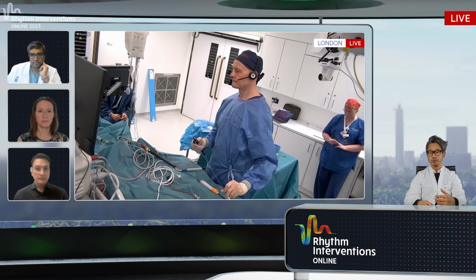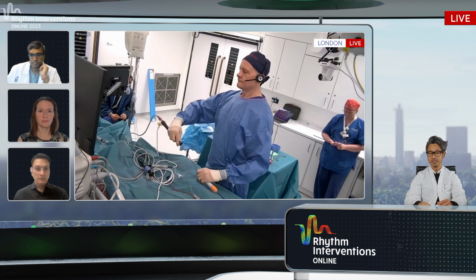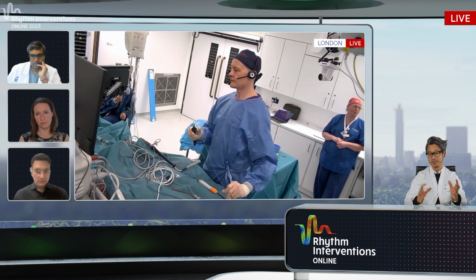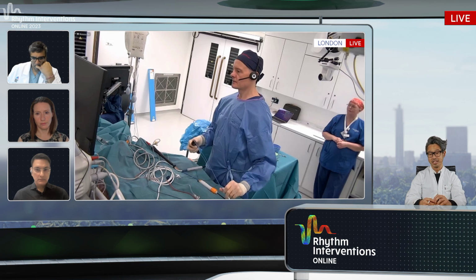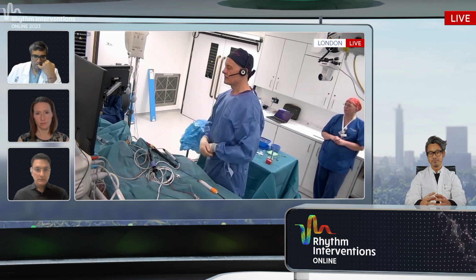Would you always go right away to enter the left atrium, or would you also do some, let's say, basic analyses of electrograms to consider? And you mentioned also CTI flutter as a potential option, or because you want to go straight away for potential re-isolation after cryo index procedure. Just a very, very brief comment on this.